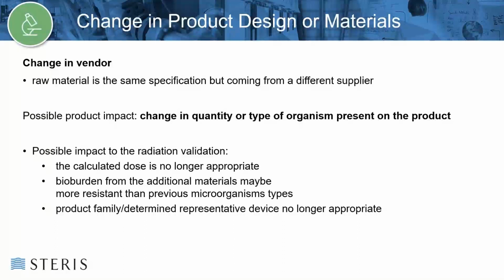Bioburden from the additional materials may be more resistant than previous microorganism types. Product families determined and representative products may no longer be appropriate.